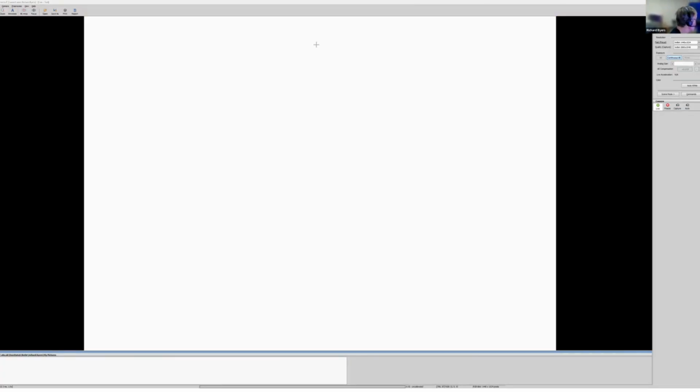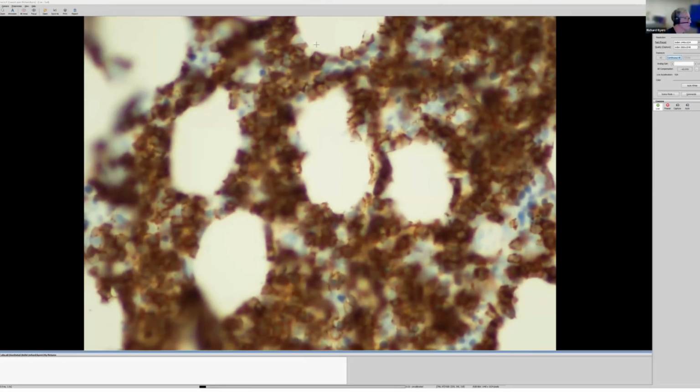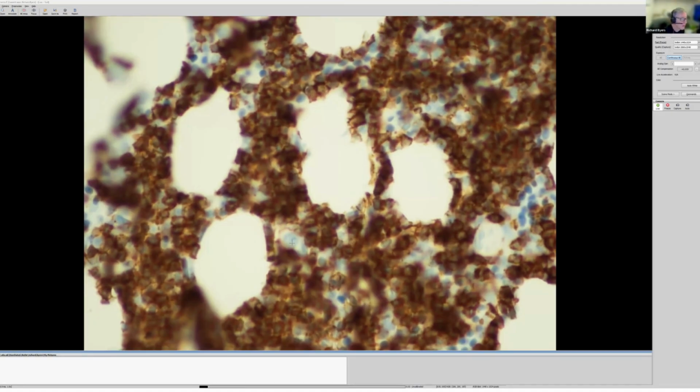Those larger cells look to be negative for CD20. Negative for CD20. So it's going to be a complex case, really. We'll see what the SOX11 and LEF1 show, and we'll see what the cytogenetics shows. But it looks to be mantle cell rather than CLL.